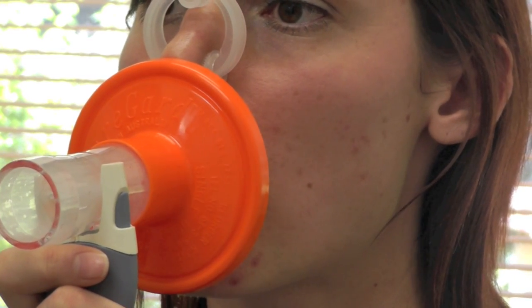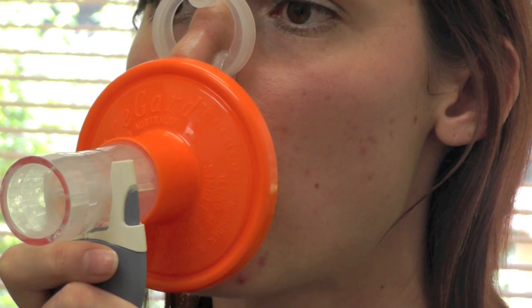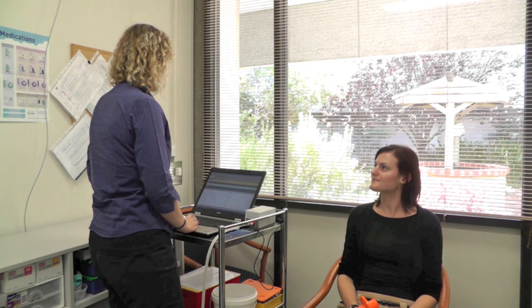Blast it out. Keep going, keep going, pushing, pushing, until you've got nothing left at all in your lungs. We can also depend on how fit you are, how tall you are, how old you are, how overweight you are, whether you smoke or whether you don't smoke. Everything plays a factor in your lung health.